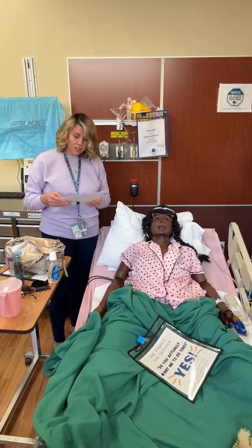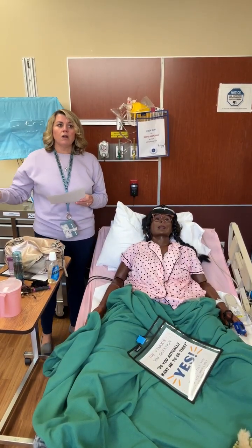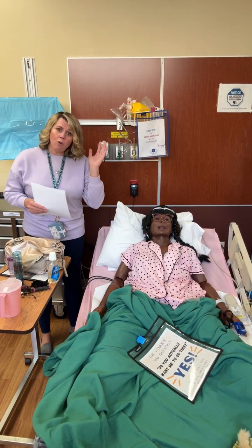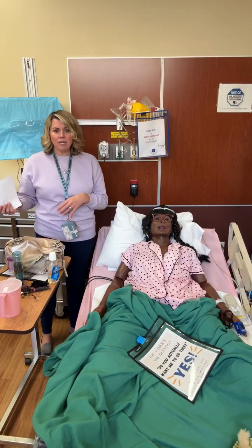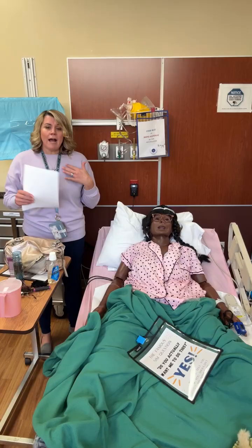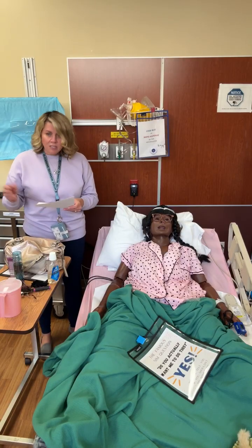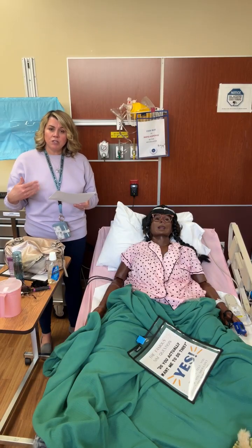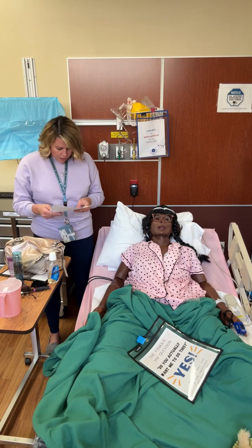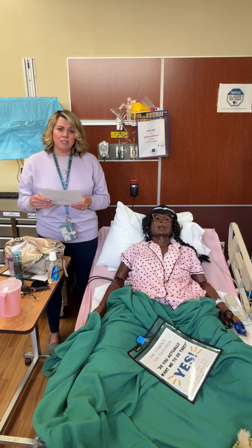And then your simulation may have a live actor. So if your instructor or one of the sim staff walk in, they're probably going to say, "Oh, I'm Dr. So-and-so," or "I'm the patient's granddaughter," or something like that. That simply means that they're acting as somebody because it's part of the script of the simulation. You'll continue your sim, continue doing what you're doing under the impression that you are communicating with that role player now. For Carla Rogers, there are 5 stages for this simulation.